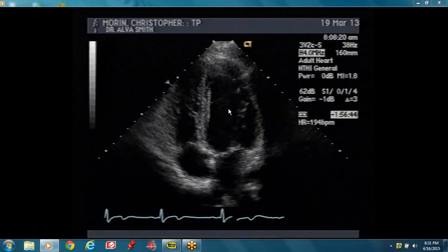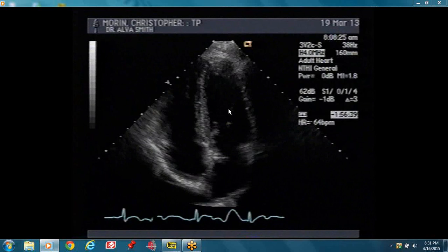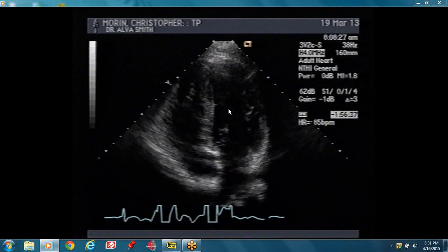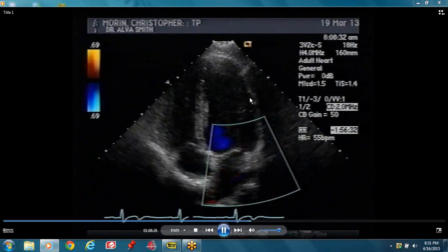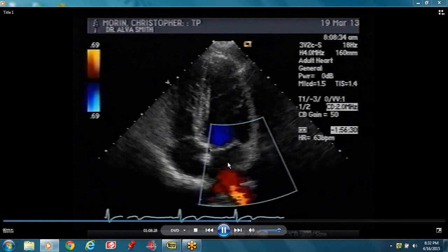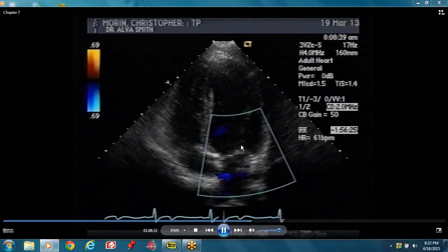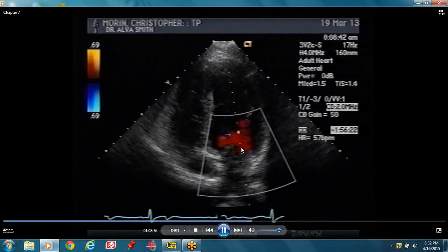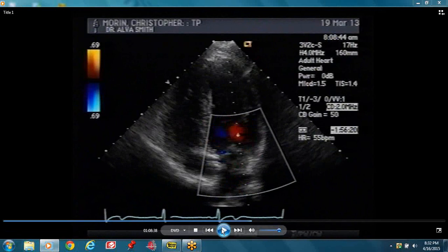This would be someone with a normal ejection fraction. If you were able to do your modified Simpson, this ejection fraction would be about 60-65%. We put color across the mitral valve — develop a routine. What you are looking for is regurgitation. Color flow Doppler is a form of pulse wave Doppler and it will give you an indication of the regurgitation.